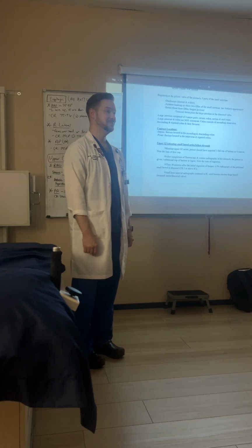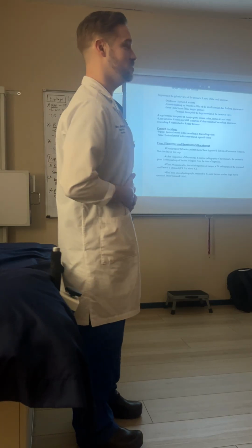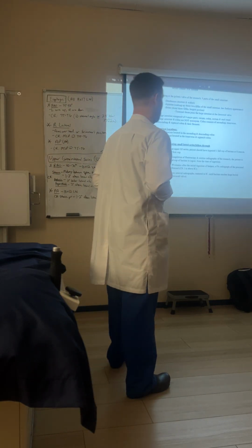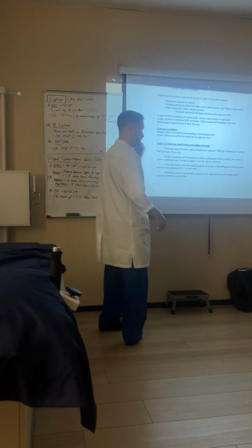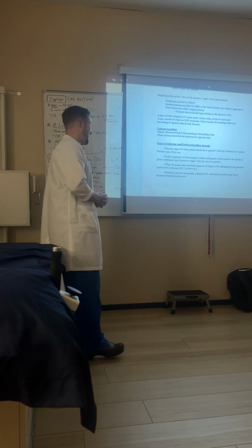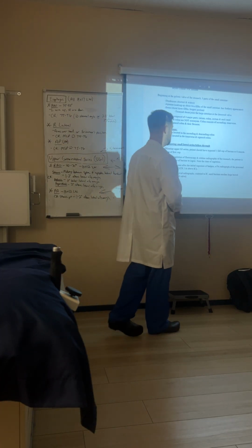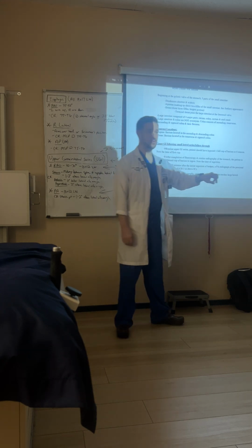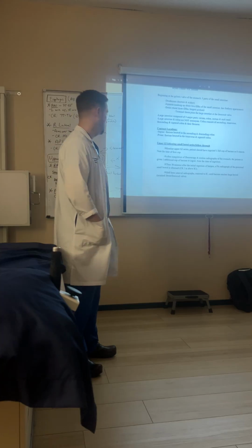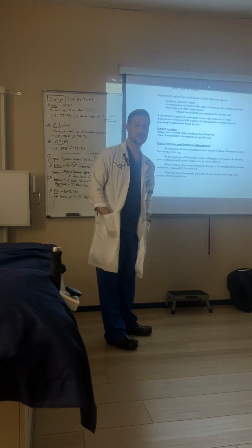All right. We're going to use the compression of the patient lying on their abdomen to help separate some of those bowel loops. Okay? So lying on their stomach helps to kind of separate the bowel loops a little bit. Half an hour interval radiographs are going to be continued until the contrast has reached the ileocecal valve or the TI, which is also the terminal ileum. Okay? Questions? Anything to add?